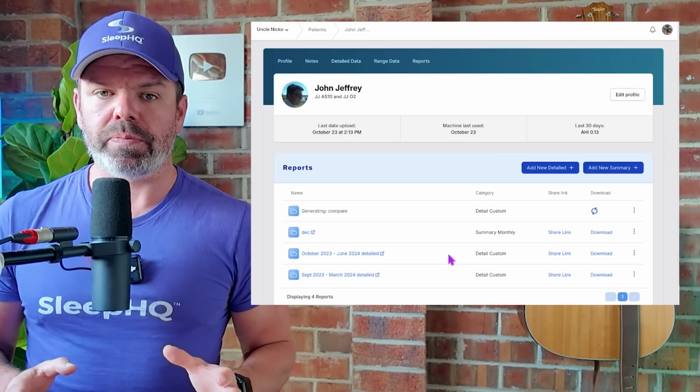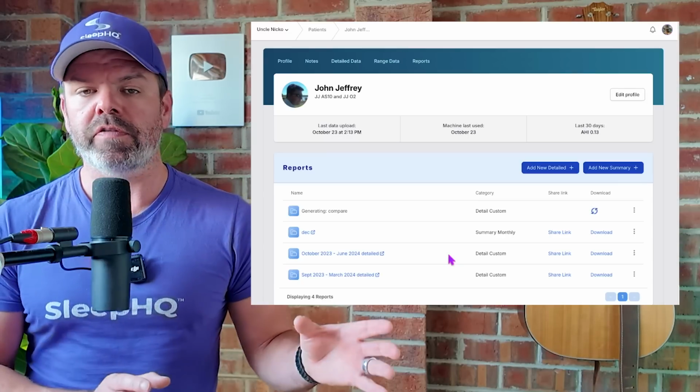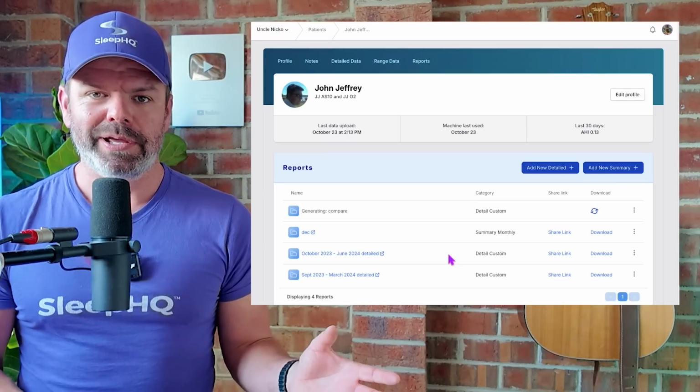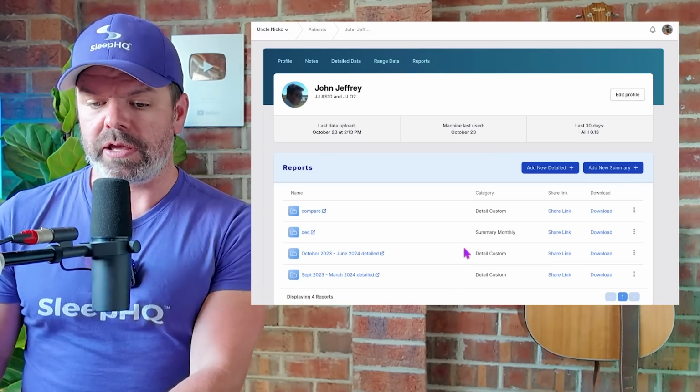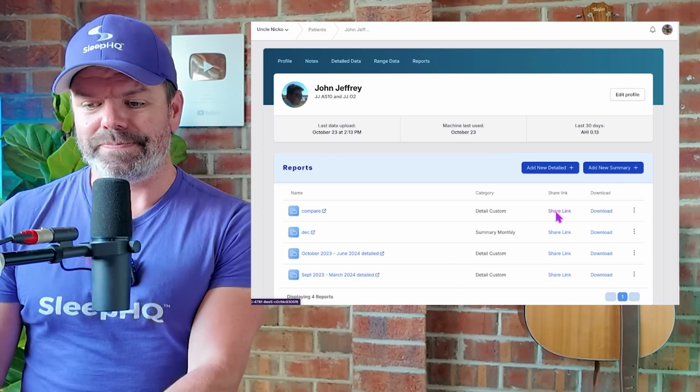Now, if you're generating a report with a year of data versus a year of data, it might take 5 minutes or so. If it's a week, it'll be really quick. If it's a month, it'll be really quick, and it's ready to go. So let's have a look.